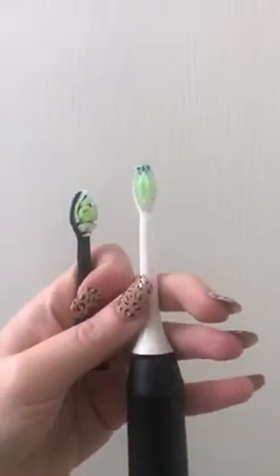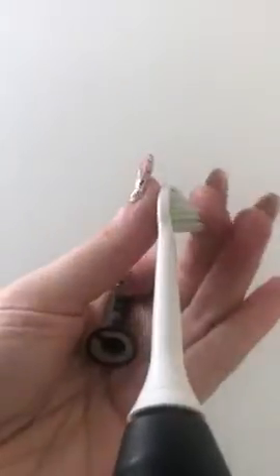I did read some of the reviews on the blue set and it did say that the bristles were hard, but these bristles are actually really soft. They remind me of the Diamond Philips ones — they look almost identical, and they feel about the same.